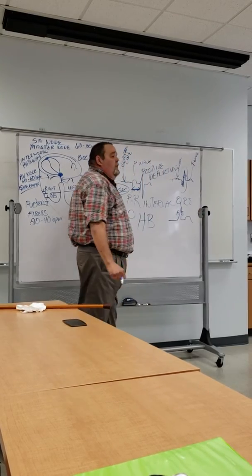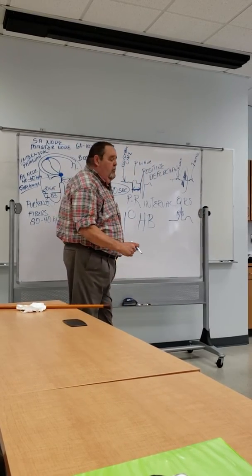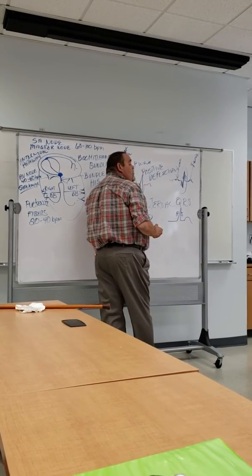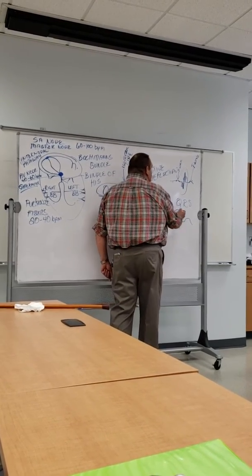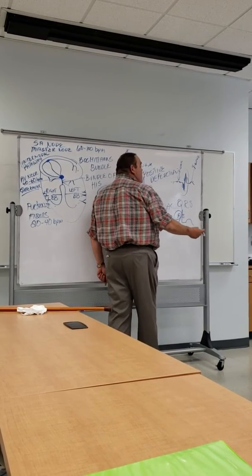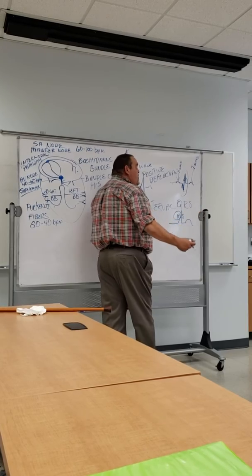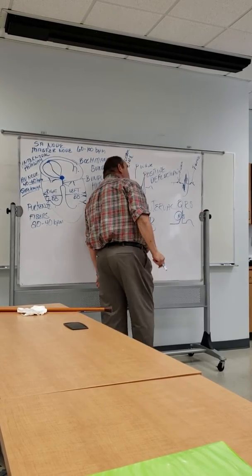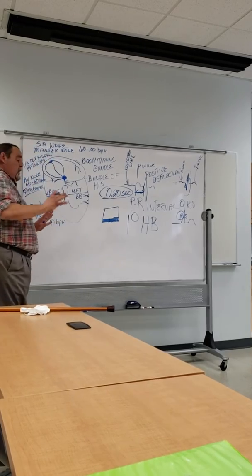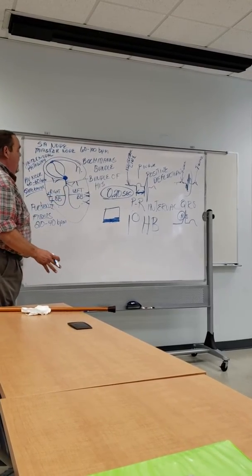It's just got that name, but the first positive deflection off that isoelectric line is going to be your R wave. If there is a negative deflection off that isoelectric line first, then that's going to be a Q wave. Okay, do we have that? Any questions about that? Anybody?